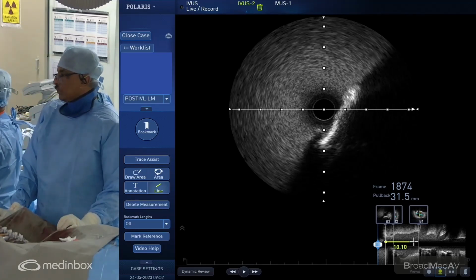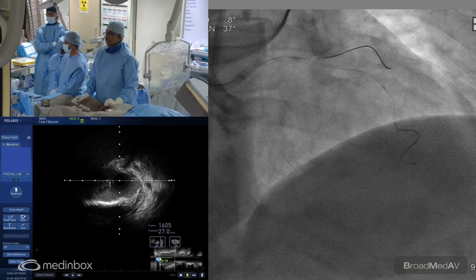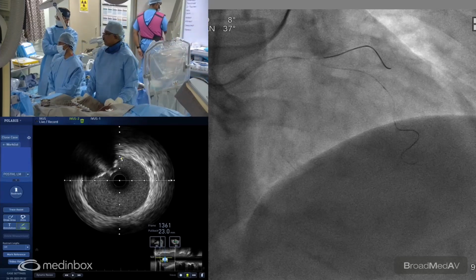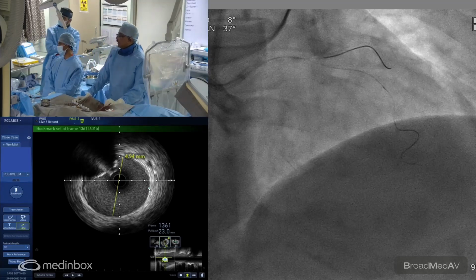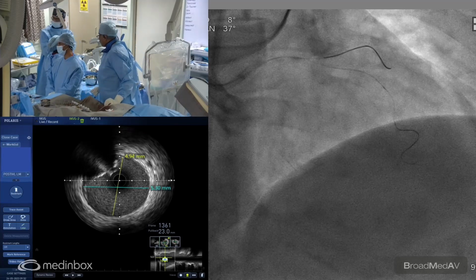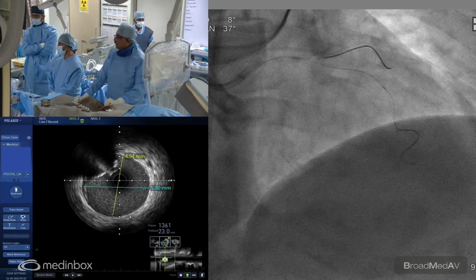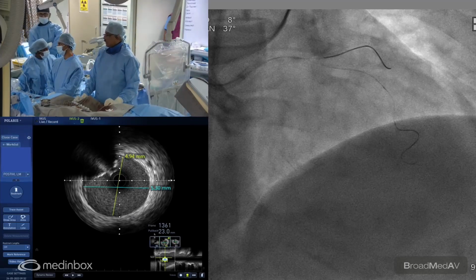So what we need to do is basically get a stent which is 4.0, and then we will see how it comes up and then decide. And as the EBC criteria says lower border, so we'll go to the LAO cranial and see the lower border, and then position our stent carefully there. Any other comments? So at the shaft of the left main, the vessel size is 5 to 5.25. So maybe we will take a post dilatation balloon 5 and do it, and if at all malapposition is there, then we will take a call too.